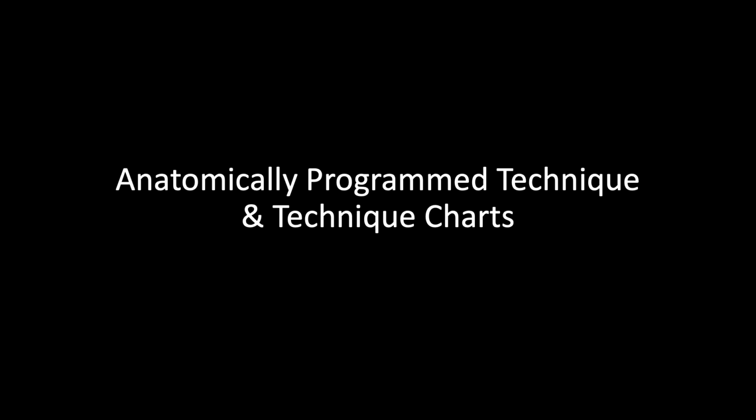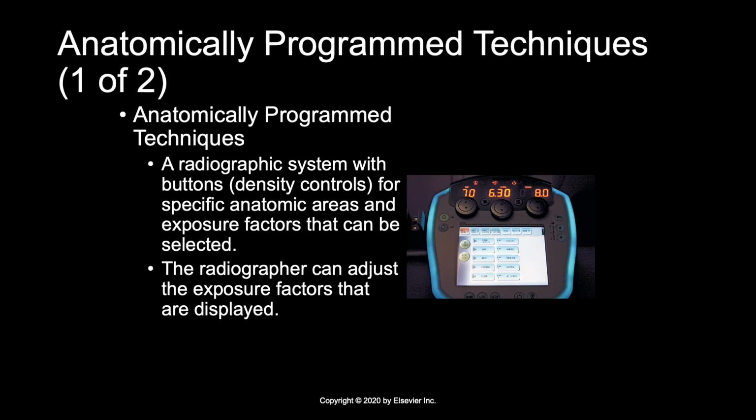Anatomically programmed technique and technique charts. And this is part 2 from chapter 13 in the Faber-Johnston book, Essentials of Radiographic Physics and Imaging. Anatomically programmed techniques, or anatomic programming.